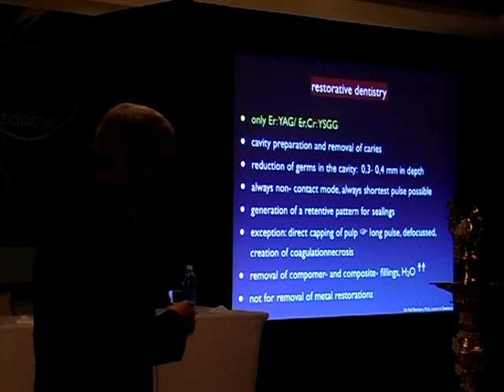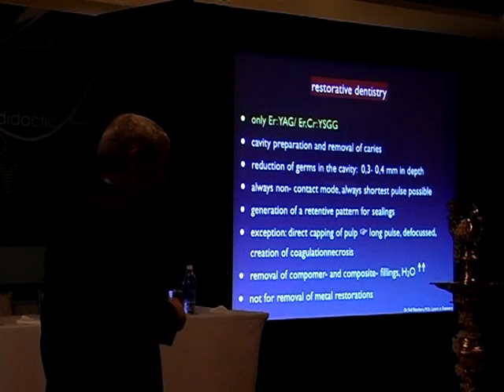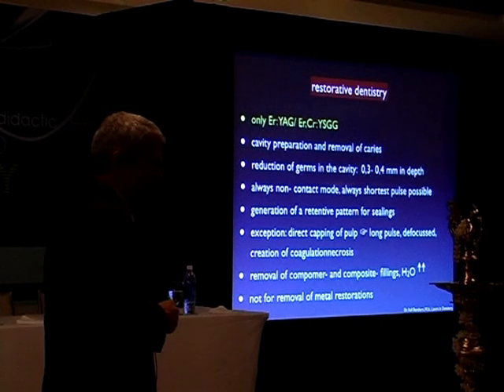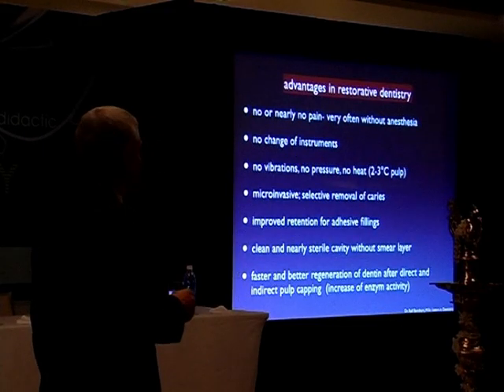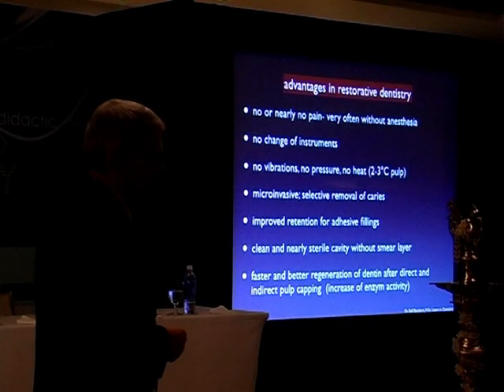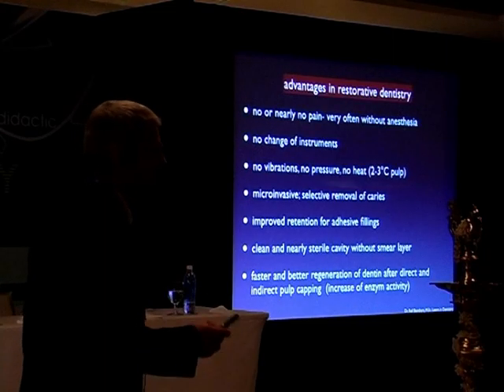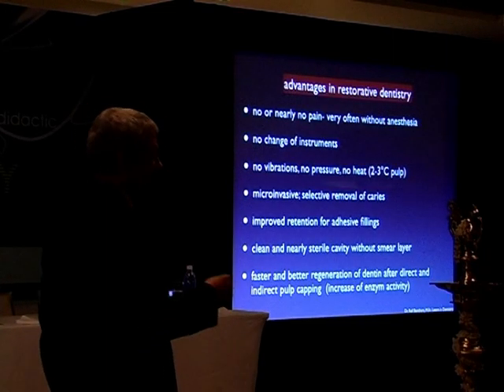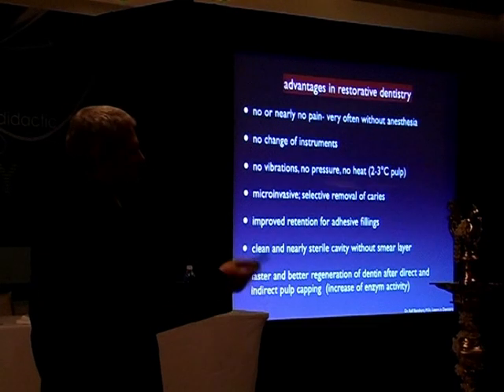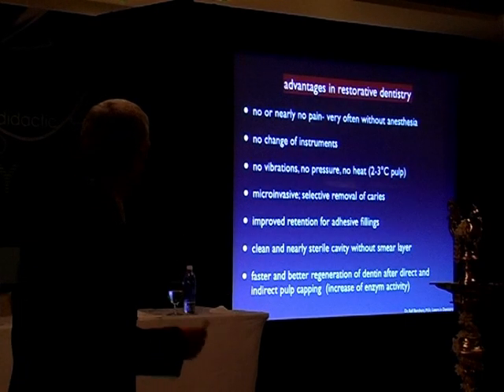You can remove composite and compomer fillings with a higher amount of water with the erbium YAG, but you cannot remove metal restorations. The advantages in restorative dentistry are, of course, you have no or nearly no pain. Let's say 98% of the time you can perform the complete restorative dentistry without any anesthesia, and no one will complain. You do not have to change the instruments. If you do it with a burr, you have to change burrs, but not with an erbium laser. You just change the parameters.